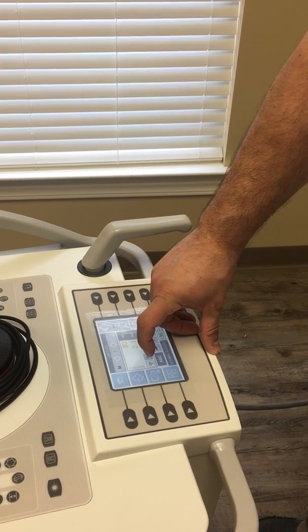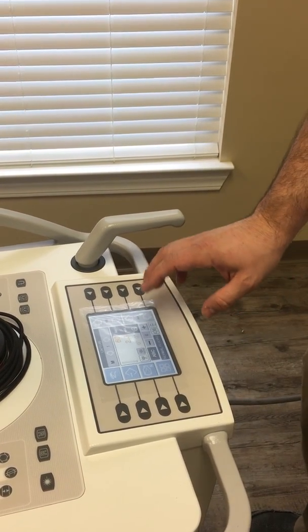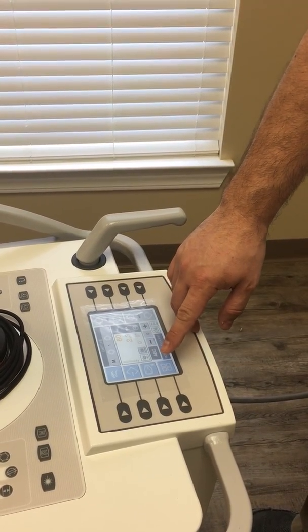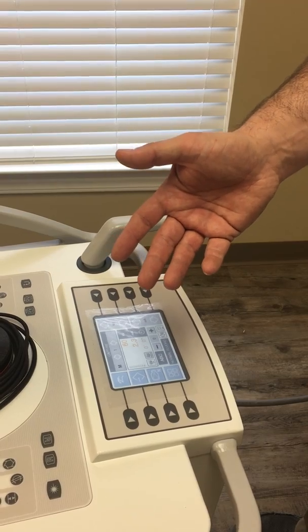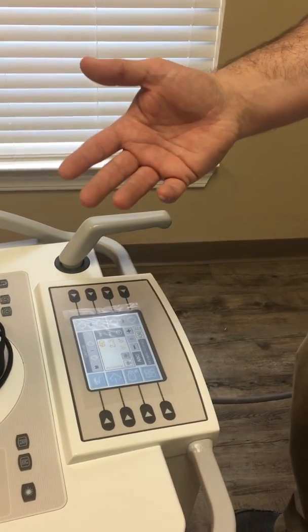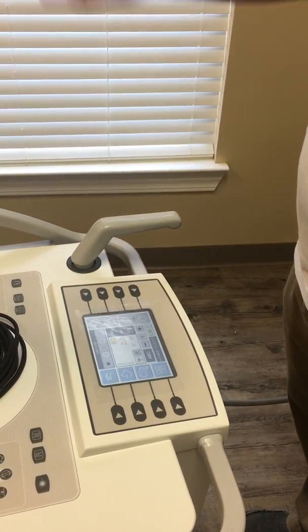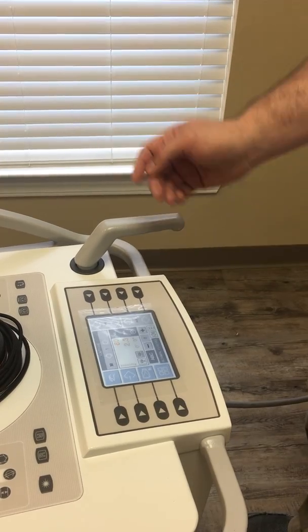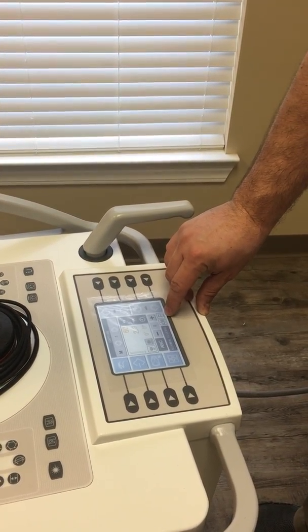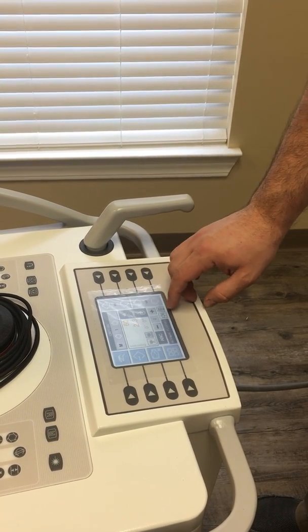You'll notice there's a roadmap icon that's grayed out. The way this system handles road mapping is that you have to shoot a DSA, so you have to acquire a subtracted image. Once you've acquired the subtracted image, then if you want to use a roadmap, you can hit roadmap, and then it'll turn it on for the next time you fluoro. Then here we just have a Cine button, so you can just do a Cine record without the DSA on and off.